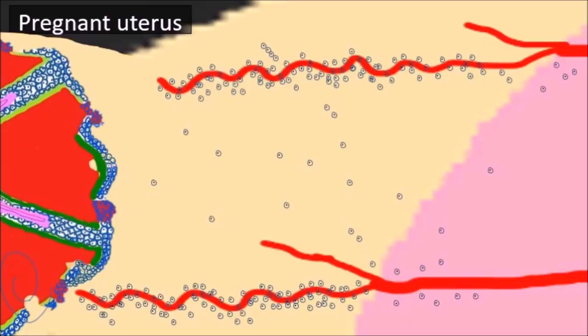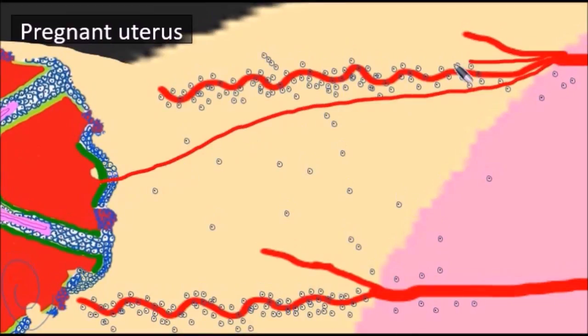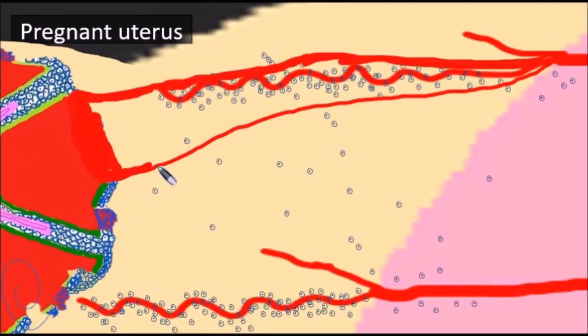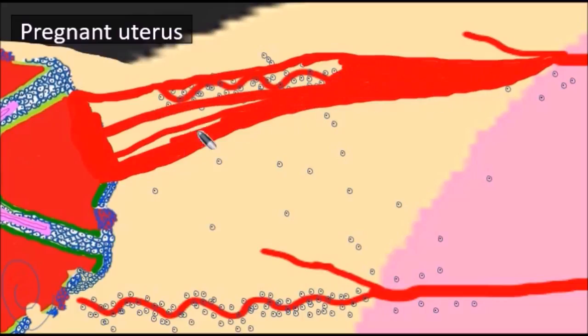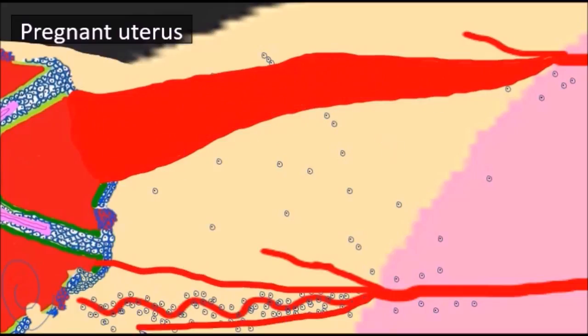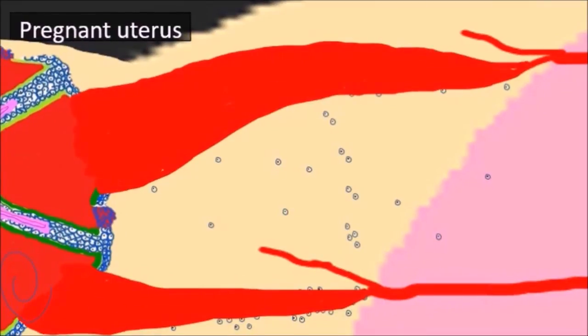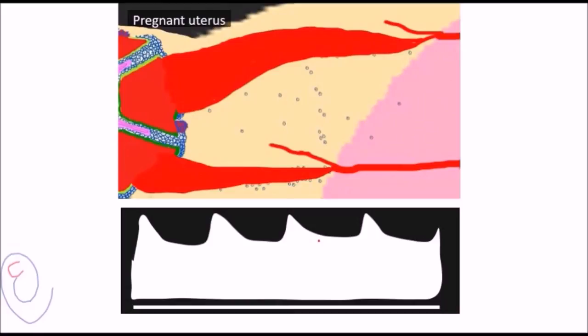This trophoblastic invasion results in remodeling of the spiral arteries, in which the spiral arteries become dilated capacitance vessels with very low resistance. These changes alter the shape of the uterine artery Doppler. The notch will disappear and the end-diastolic flow will markedly increase.